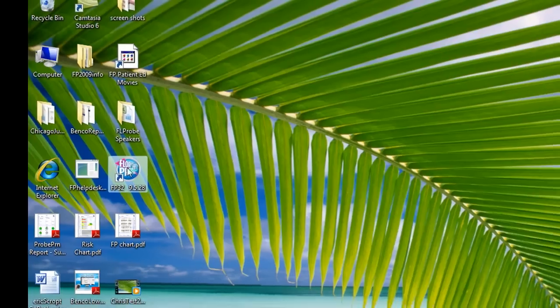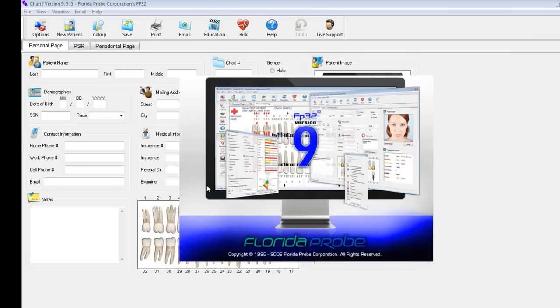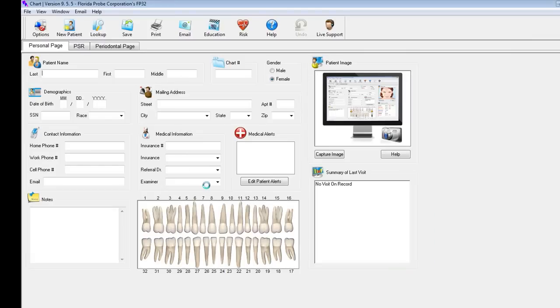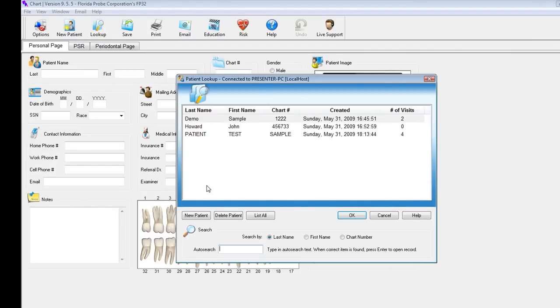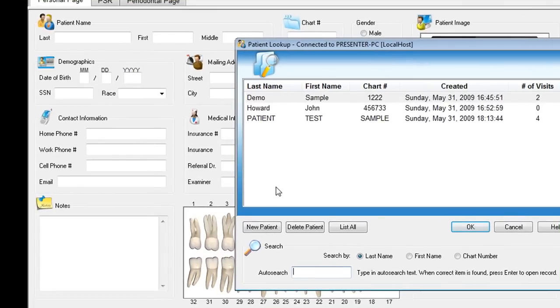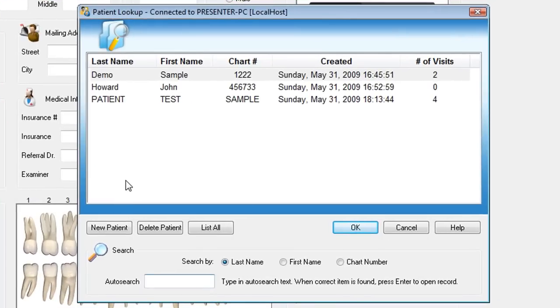Double-click the icon to get started. Florida Probe can link directly into your practice management software — we link with over 50 different practice management software products worldwide. When the software first starts, it's automatically looking for which patient you want to enter today. You could either bring up a patient of record and add another visit to their name, or create a new visit by clicking the New Patient button.